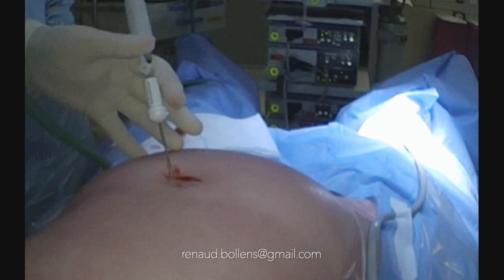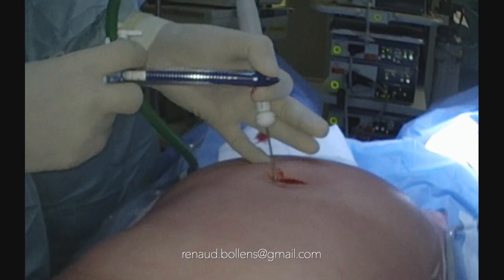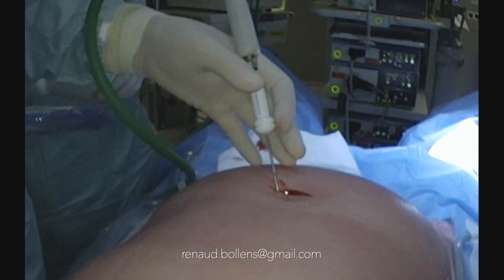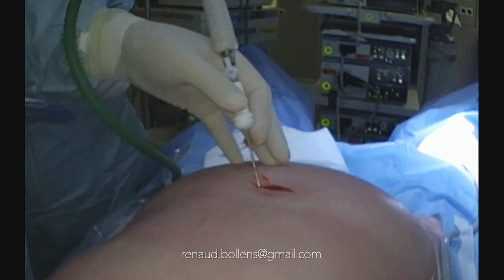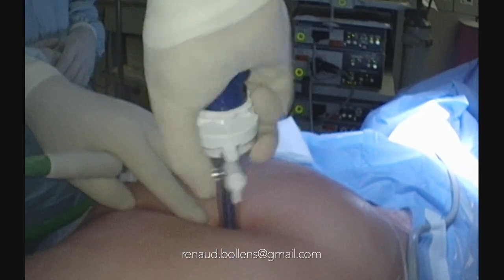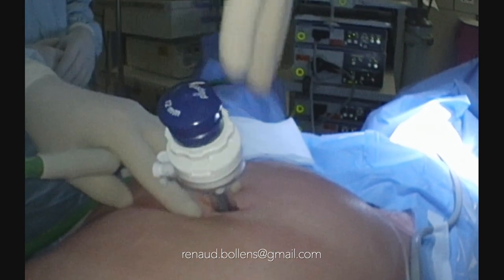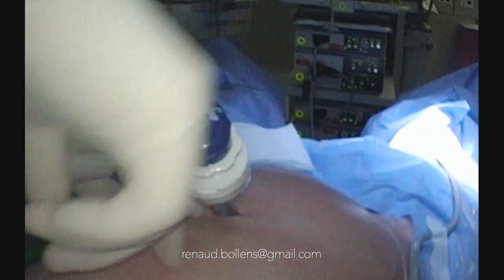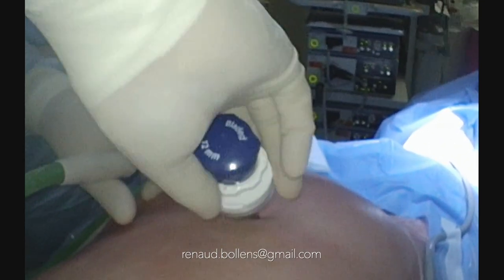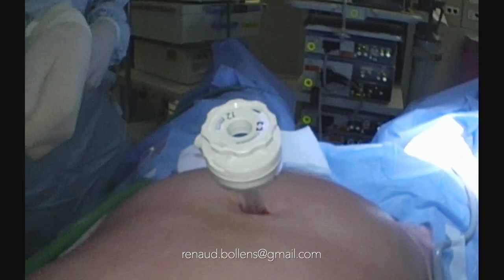Here, I prefer to use a port with the blade because it enters more smoothly than a dilating port. But it's more a question of personal preference. I screw to dilate also the wall to enter. Don't push in one direction, in one movement, because it's the best manner to have the wall go down and then you can touch something. That is important also with the blade, to dilate the passage when you enter the port.